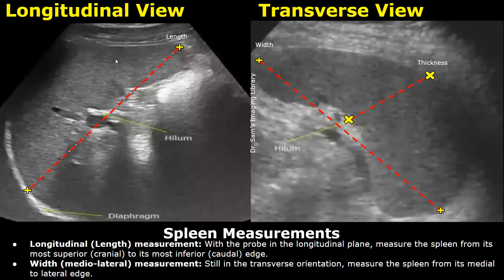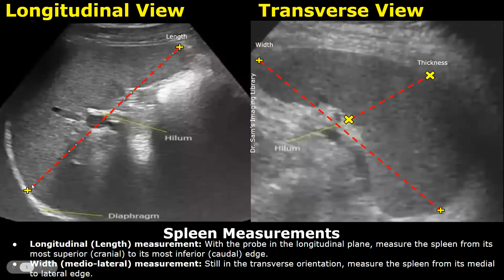After locating the spleen on ultrasound in a longitudinal view, you can obtain its length. When you get this image of the spleen, you can measure the length by placing one caliper just below the diaphragm. This is the diaphragm — this is the superior border of the spleen.